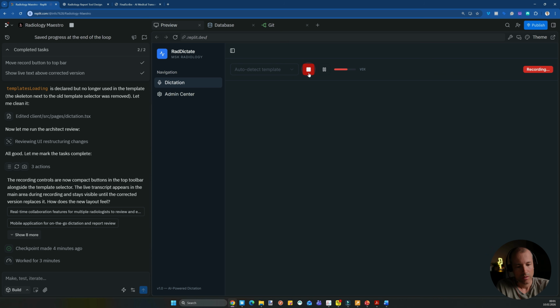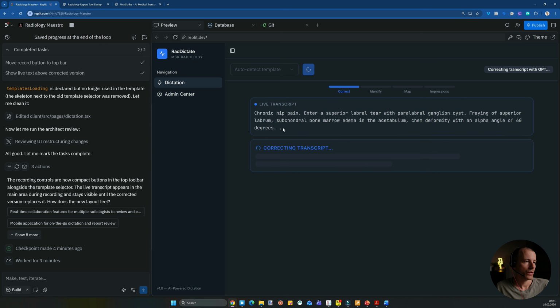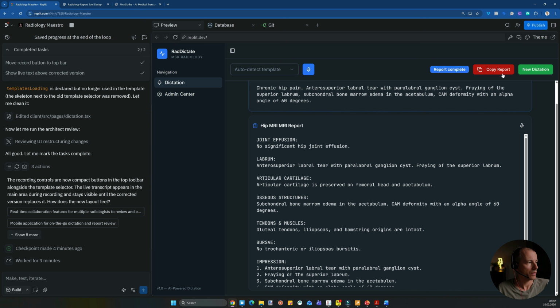Chronic hip pain, anterosuperior labral tear with paralabral ganglion cyst, fraying of superior labrum, subchondral bone marrow edema in the acetabulum, cam deformity with an alpha angle of 60 degrees. Okay, so it looks like I was just not speaking loud enough. Nice.